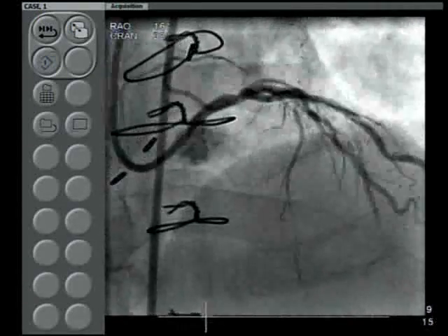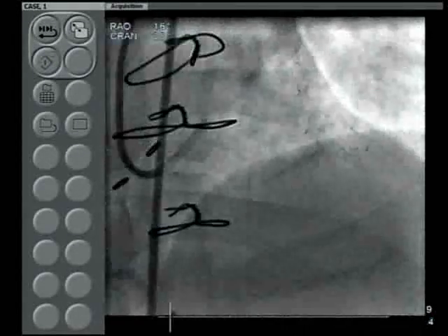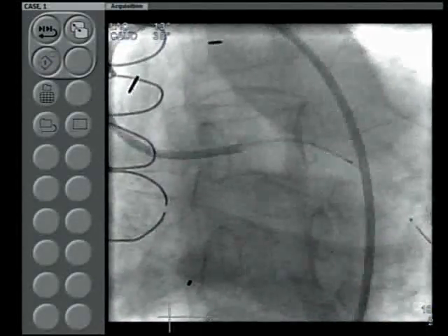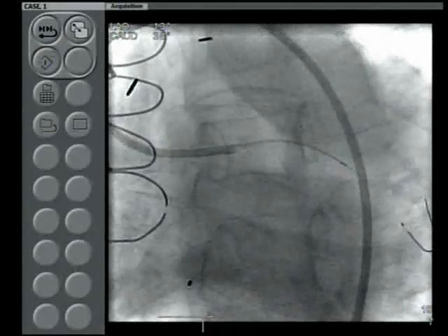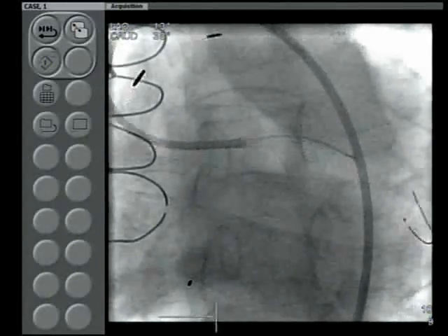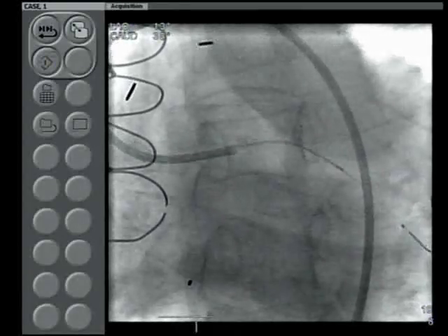But to confirm what we are talking about angiographically, how it would look with intravascular ultrasound, we can show the ultrasound. First, we did the circumflex. We knew the OM disease is significant. We did not go all the way down to the significant disease there. This is just the proximal circ coming to the distal left main.